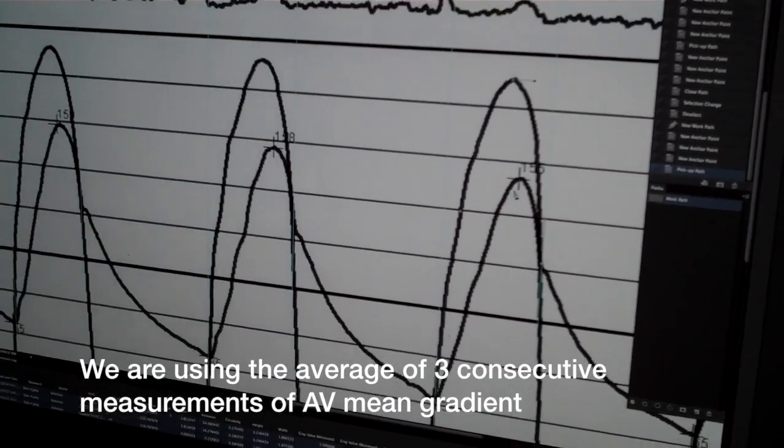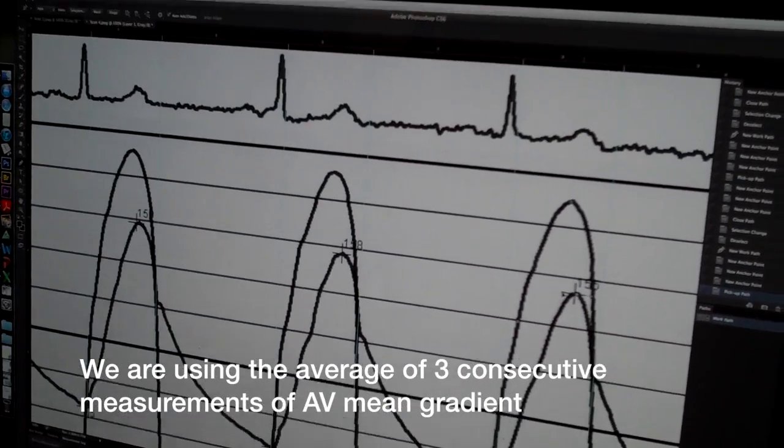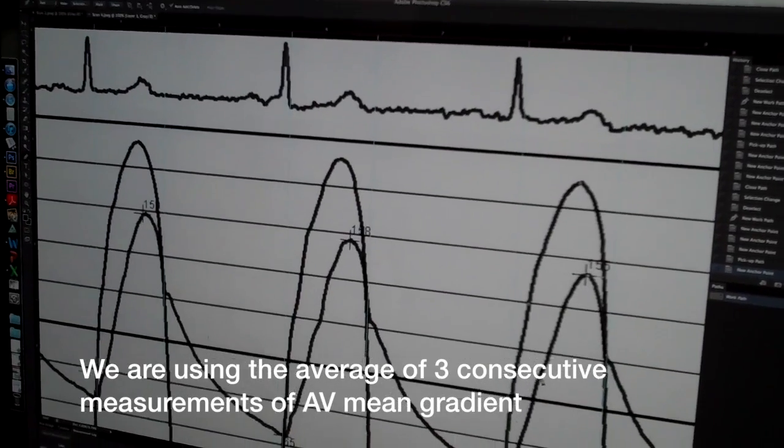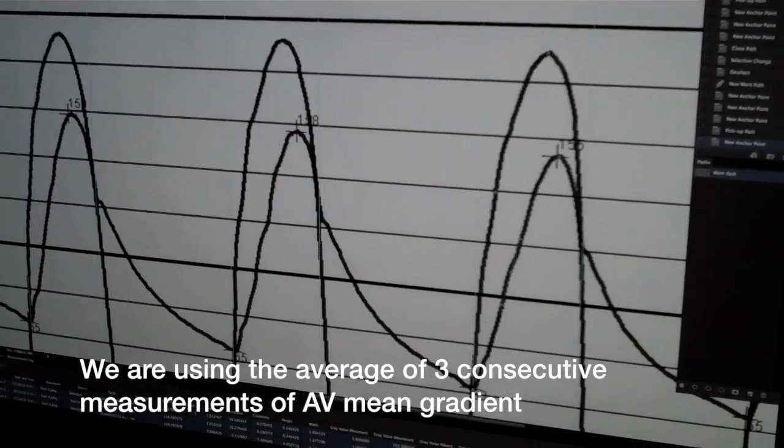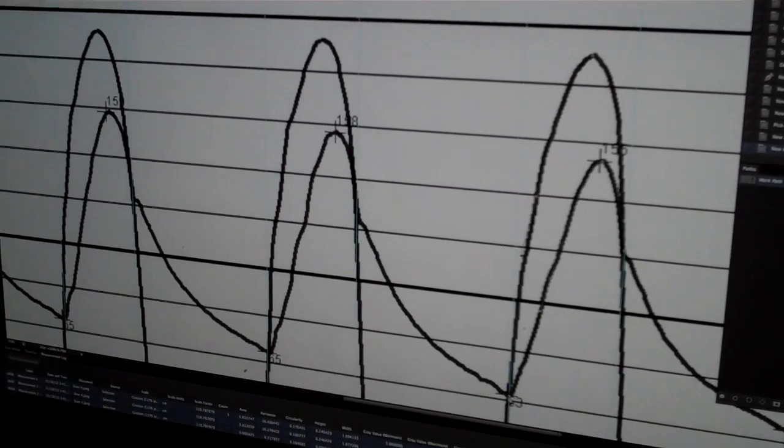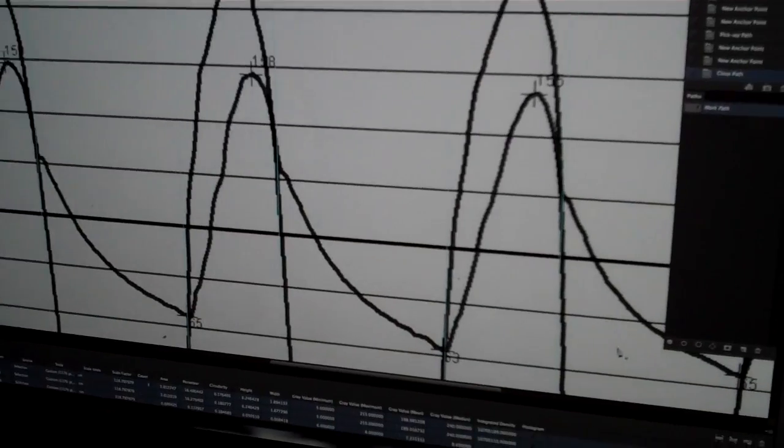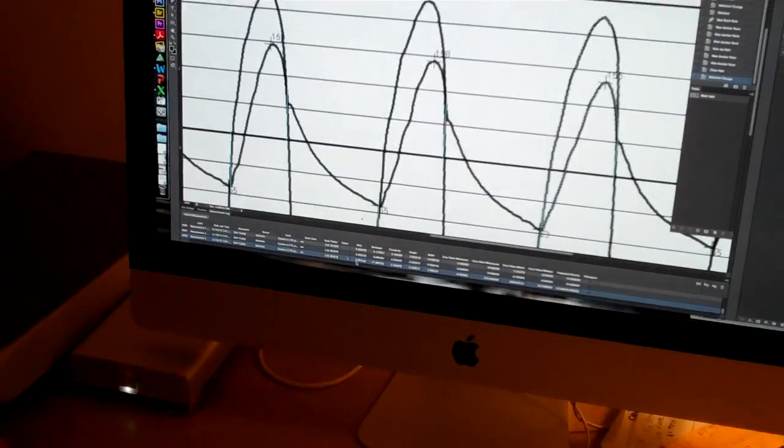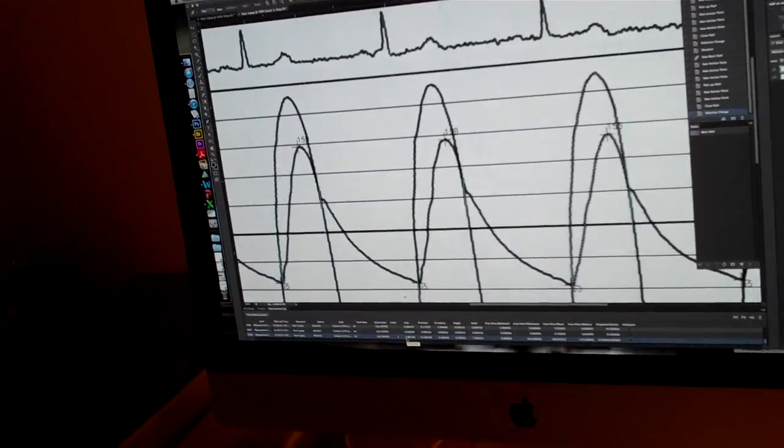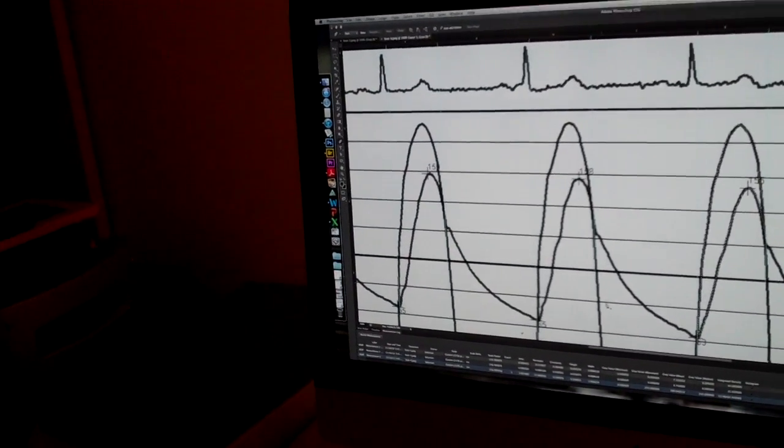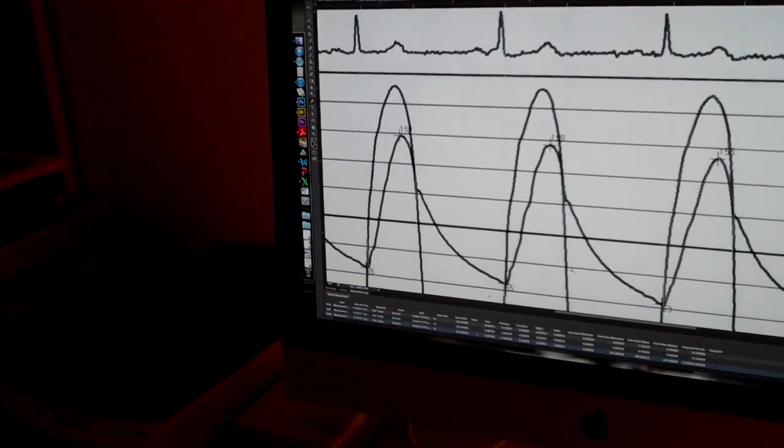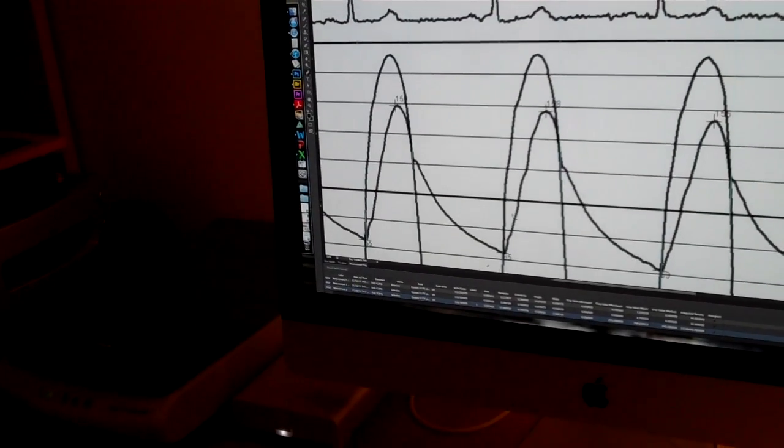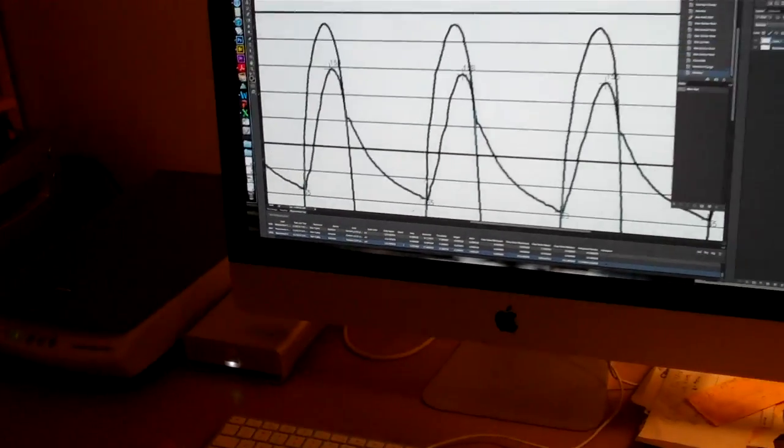And I'm going to measure this area here. So once again the pen tool comes around. Notice how I make this one horizontal. That's the proper way to use the pen tool. Make the selection. Command shift M. Measurement 3 is 3.9 or essentially 3.95 or 4.0.